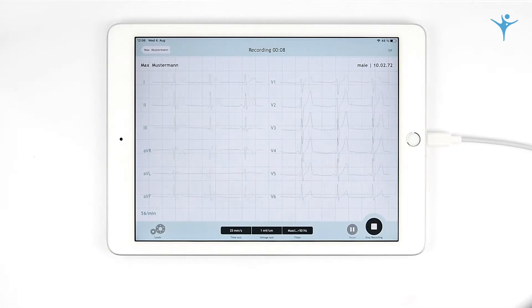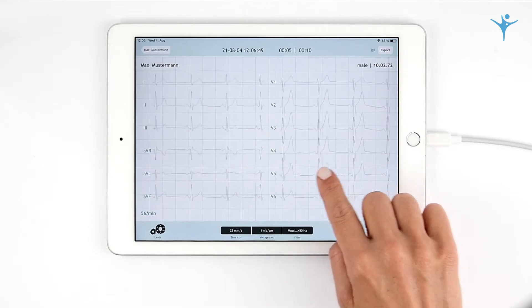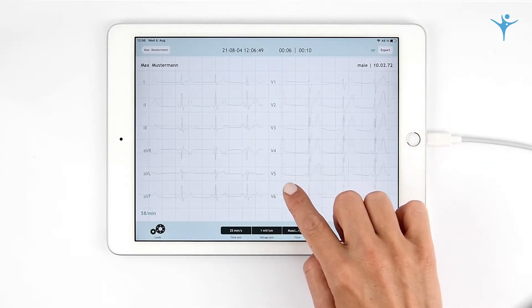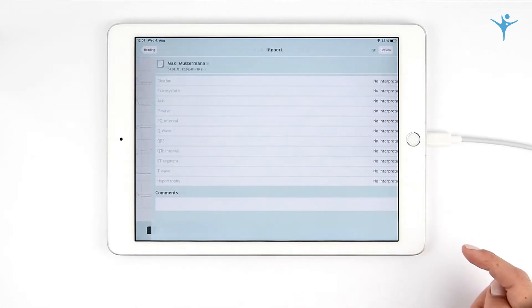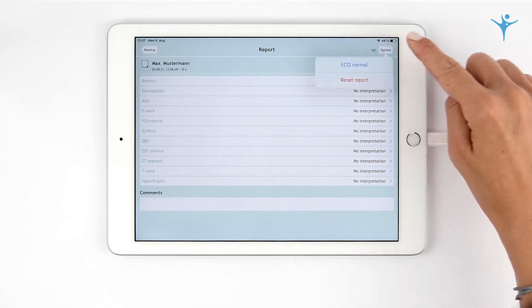Recordings can last up to 30 minutes. After recording, you may go back and forth and zoom into any segment. Here you can generate your ECG report. In case of a normal ECG, the values can be added easily to the report.